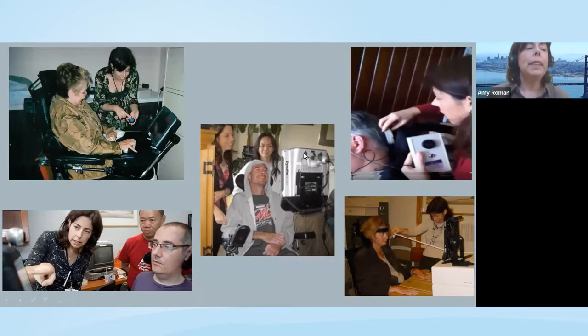My job at the clinic as the Augmentative Alternative Communication Specialist, or AAC specialist, involves working with clients and their families and support teams to develop communication solutions. You can see a few shots of me working here with families over the decades. Today I'm going to share with you some of the insights that I've gained from my clients and their caregivers that shaped the features of AlphaCore that I'll be showing you.